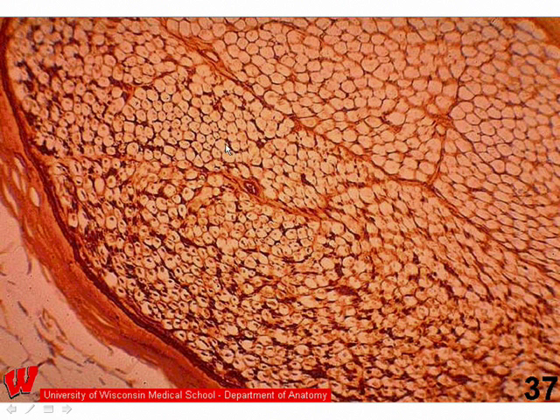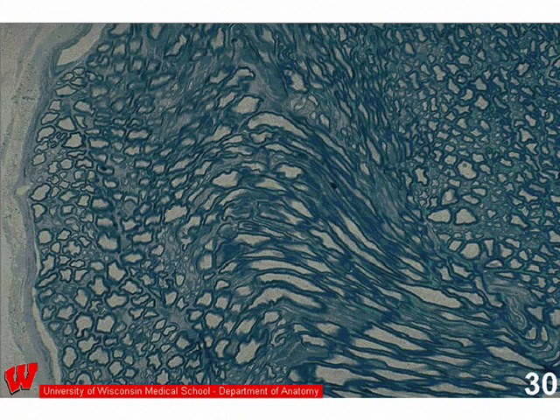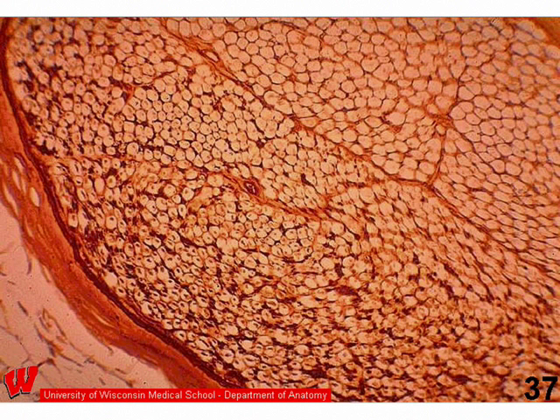The preparation of this tissue has extracted a lot of the myelin. That's why it doesn't have the same appearance. Here you can see the myelin, and in this particular structure, which highlights the 3 layers of the three neuriums, if you will, the myelin has been extracted, but you can see the remaining structure of the individual axons.